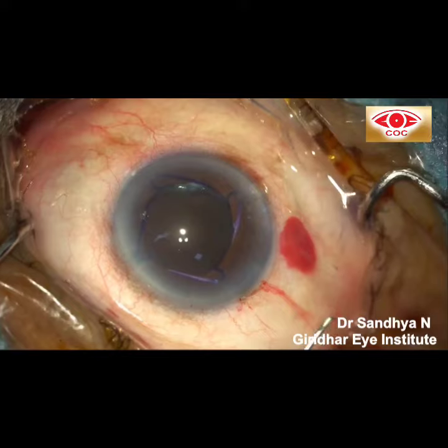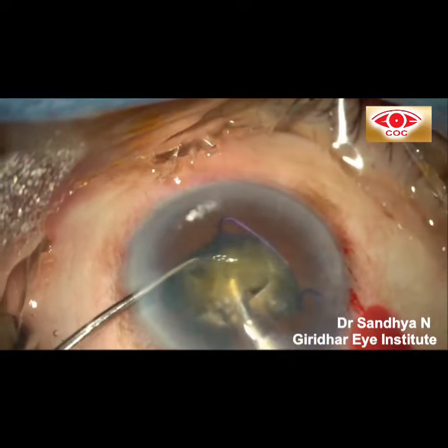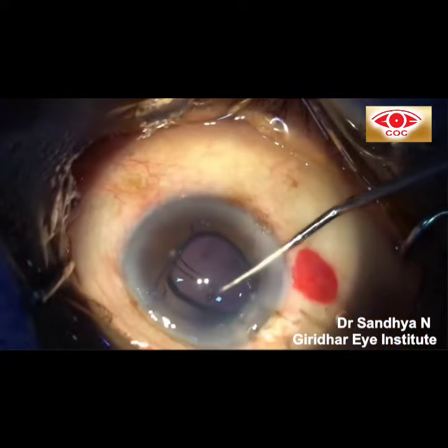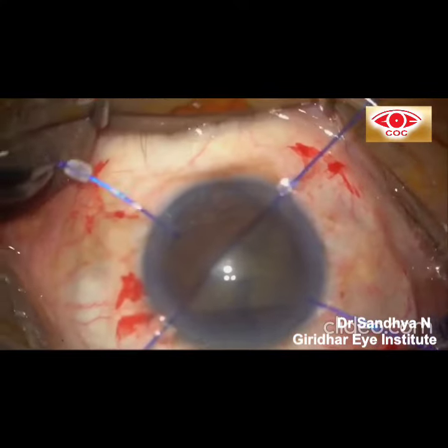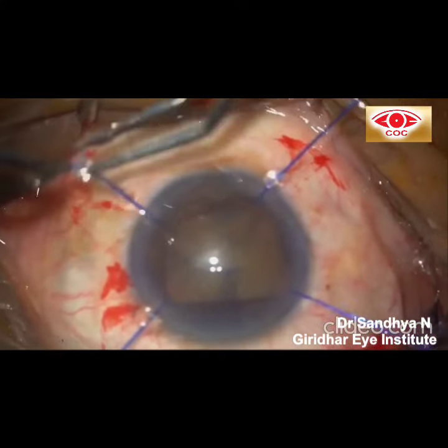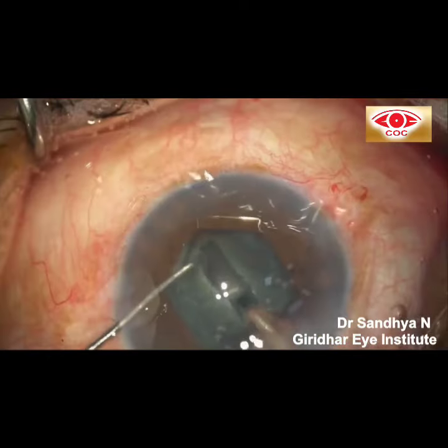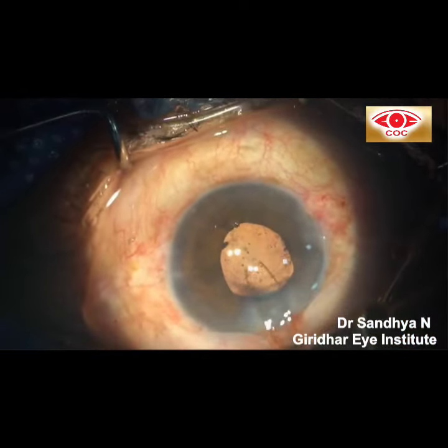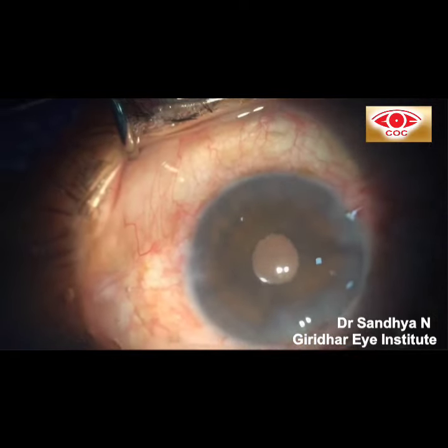In this patient with severe IFIS, where a Malyugin ring was used, the iris in between the scrolls was coming towards the phaco probe. We can use iris hooks or a Beehler ring to provide adequate visualization. If planned and executed properly, in most cases, phaco can be carried out safely in these patients.